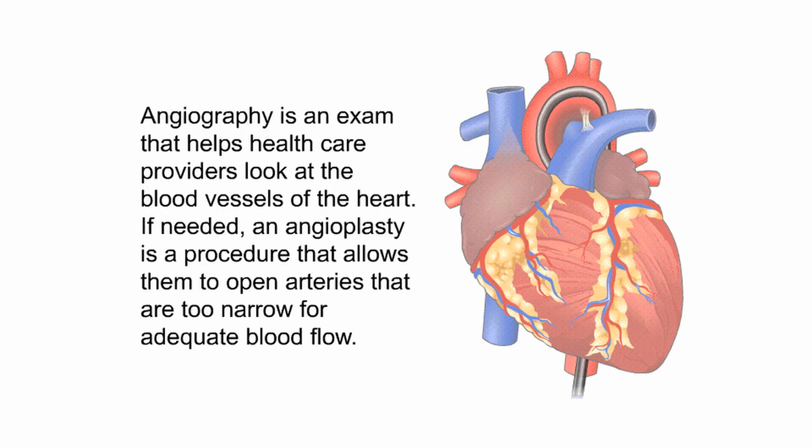Summary. Angiography is an exam that helps healthcare providers look at the blood vessels of the heart. If needed, an angioplasty is a procedure that allows them to open arteries that are too narrow for adequate blood flow.